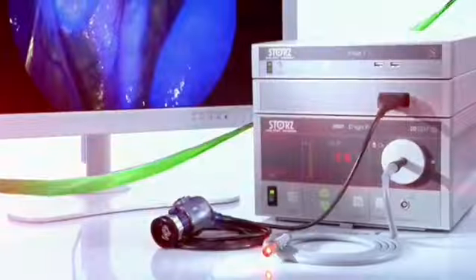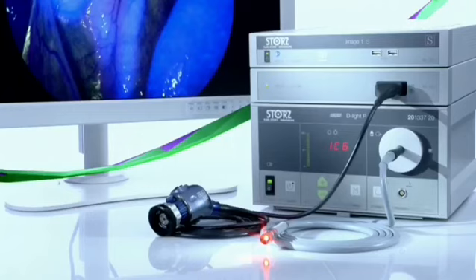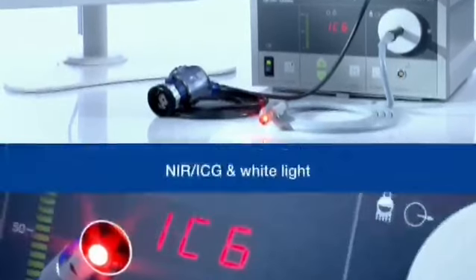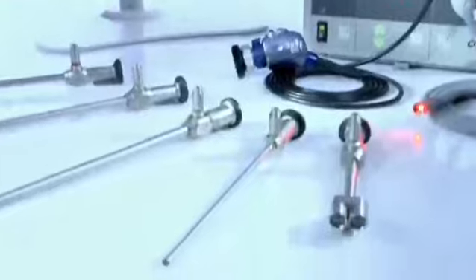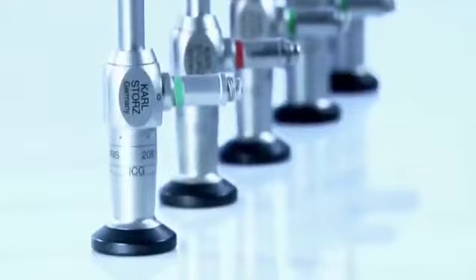Light source. The light source is normally outside the body and the light is typically directed via an optical fiber system. A lens system transmits the image from the objective lens to the viewer, typically a relay lens system in the case of rigid endoscopes, or a bundle of fiber optics in the case of a fiberscope. Let's look into the types of endoscopes. The abundance of instruments falling under the designation endoscope includes the following, with brief descriptions of each.